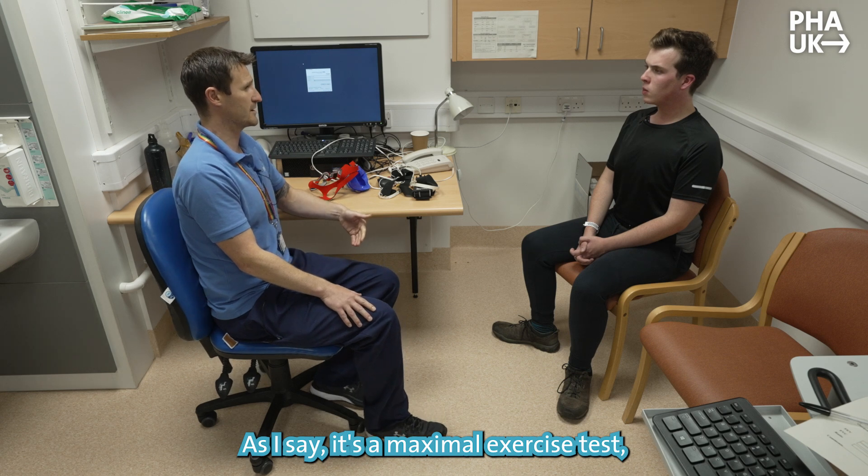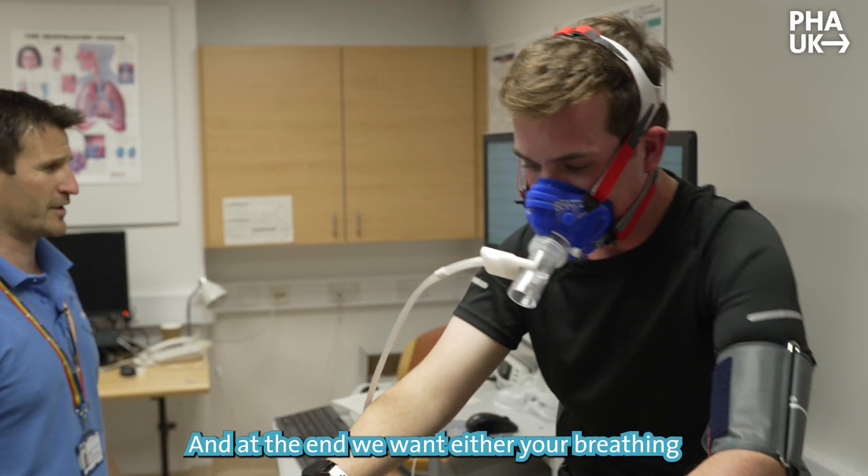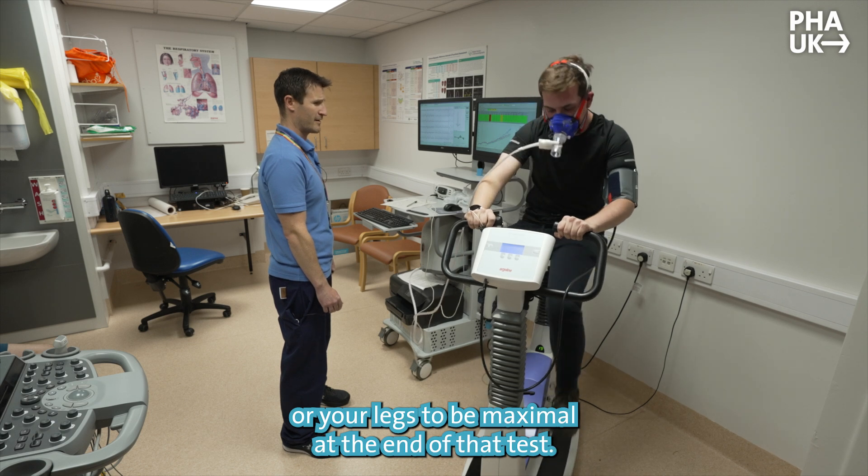As I say, it's a maximal exercise test. We want you to do as much as you can, and at the end you want to have your breathing or your legs to be maximal at the end of that test.